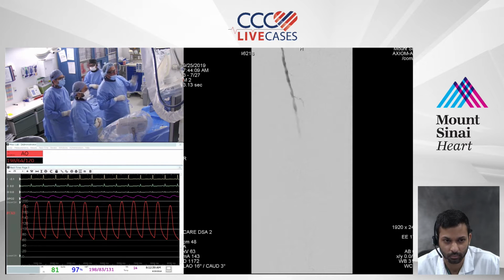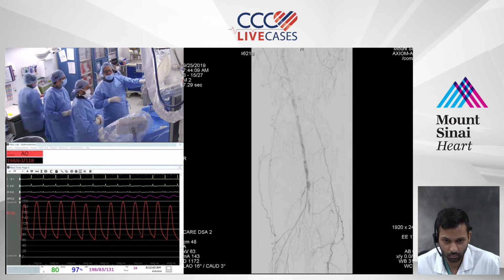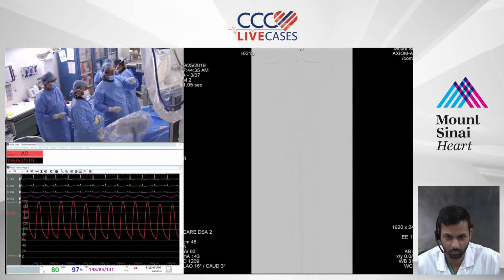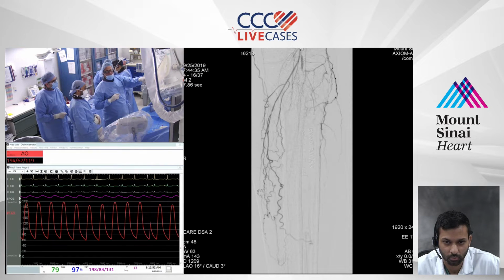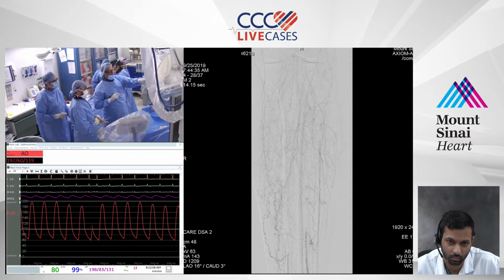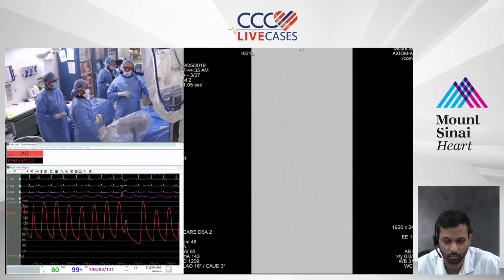So again, when I look at it angiographically, those collaterals distally, especially that genicular collateral off the pop, which gives rise to both my posterior tibial and my peroneal, comes off that large geniculate right there, to the left of your screen, or to the right of your screen, and you can see it fills the anterior tibial, the peroneal and the posterior tibial. So my goal is I don't want to knock that off while I'm trying to attempt this.